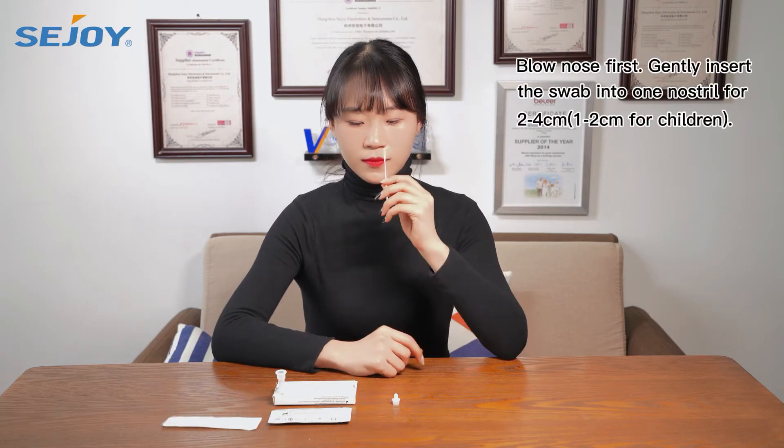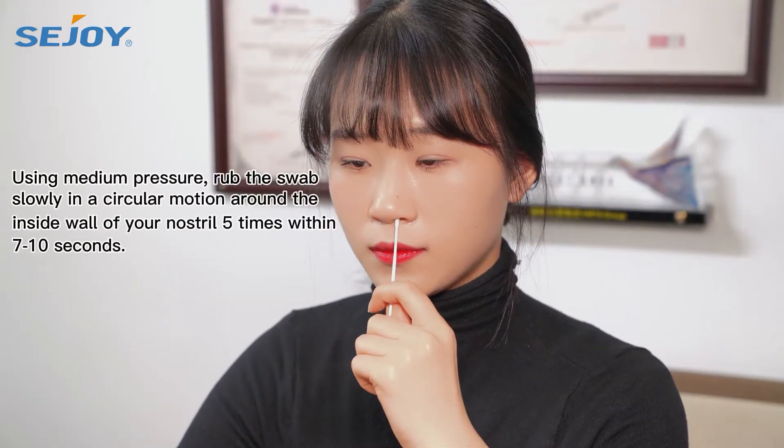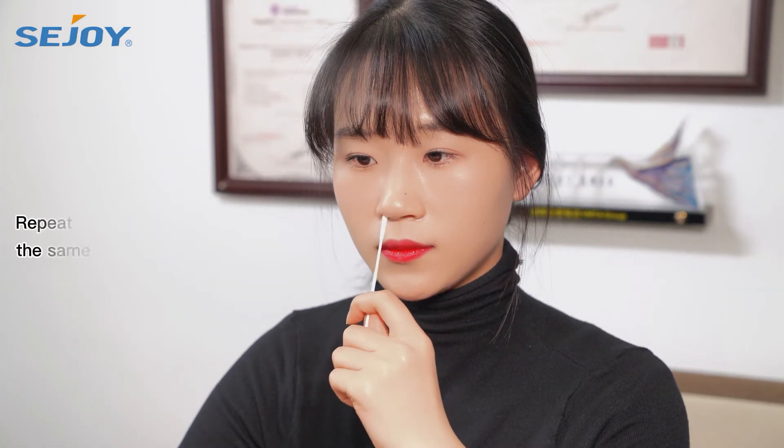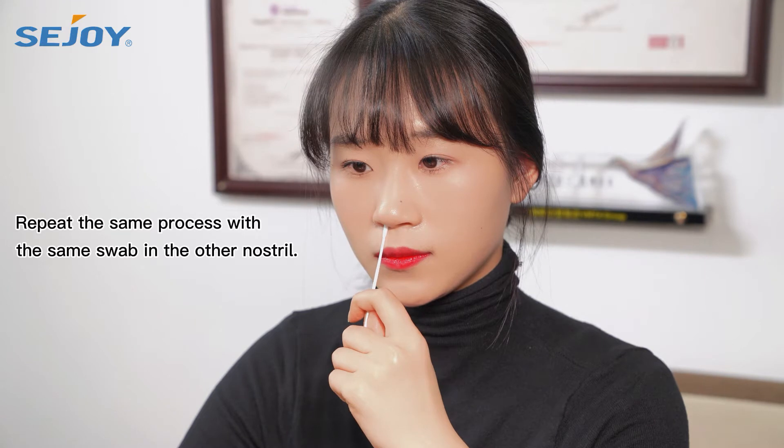Blow your nose first. Gently insert the swab into one nostril for 2-4cm and rub the swab around the inside wall of your nostril 5 times. Repeat the same process with the same swab in the other nostril.